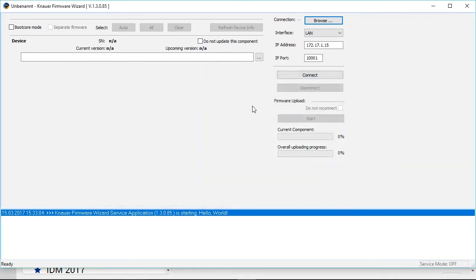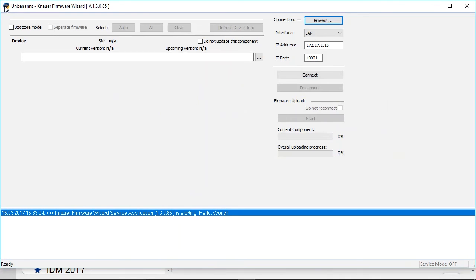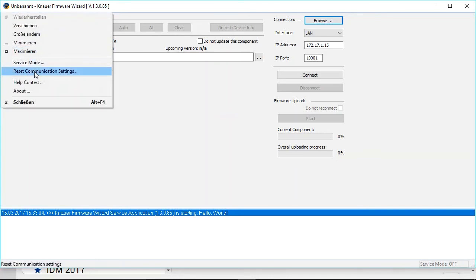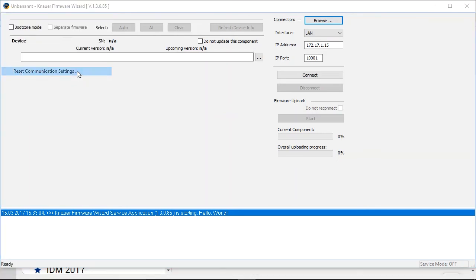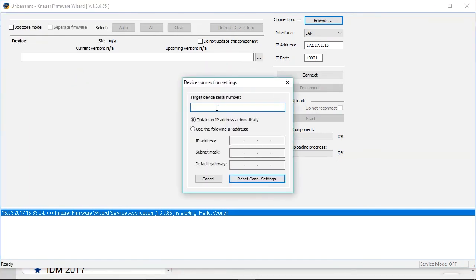So to change the IP address with mobile control is one option. Another option is to change the IP address via the firmware wizard. And this can also be easily done by just clicking here in the left corner. Choose reset communication settings. And in this case you don't need the actual IP number of the device, but the serial number.